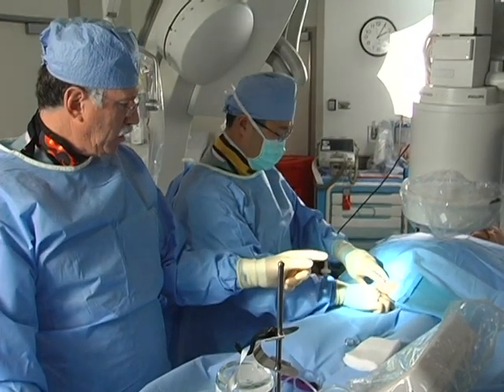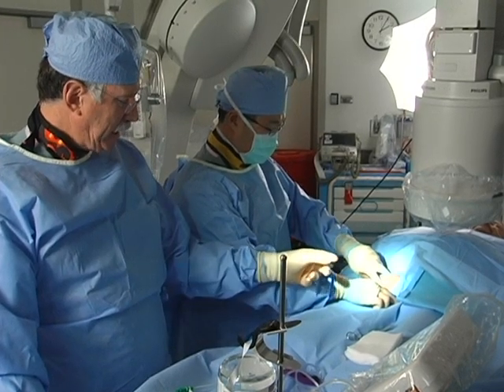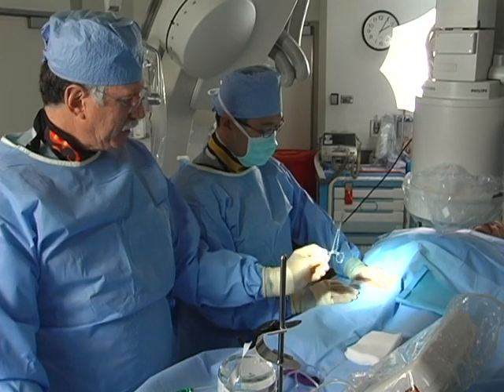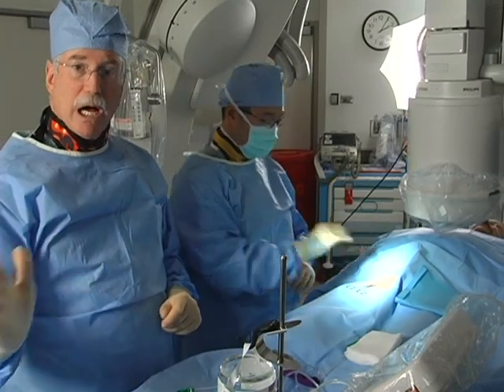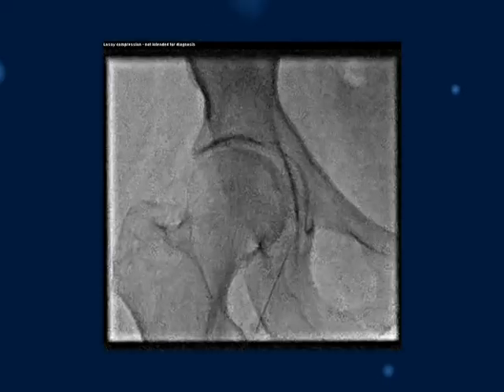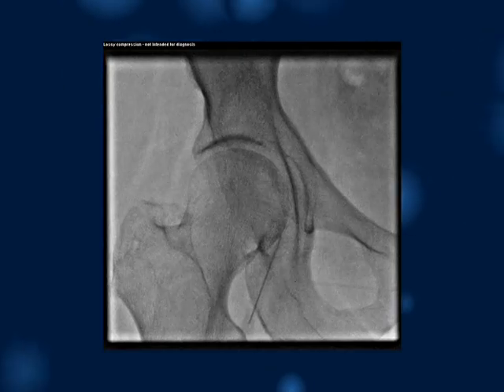The line 1 centimeter below that meeting point is the inguinal crease, and Dr. Suh is going to palpate for the artery. And when he feels it, he's going to take a marker and mark where the femoral pulse is, and we'll be able to then gauge if we're high or low for the femoral stick. So let's take a quick fluoro image. Marker is in a good position, so we know that the entry point here is correct for the femoral crease.